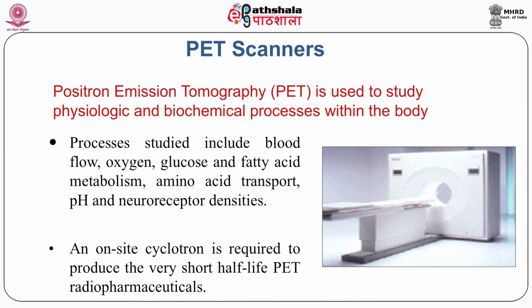An on-site cyclotron is required to produce the very short half-life PET radiopharmaceuticals, because one very important thing is that technetium-99m gives a monoenergetic 140 keV, no doubt, but its half-life is 6 hours. But here the important thing is that the radionuclides used have a very short half-life.